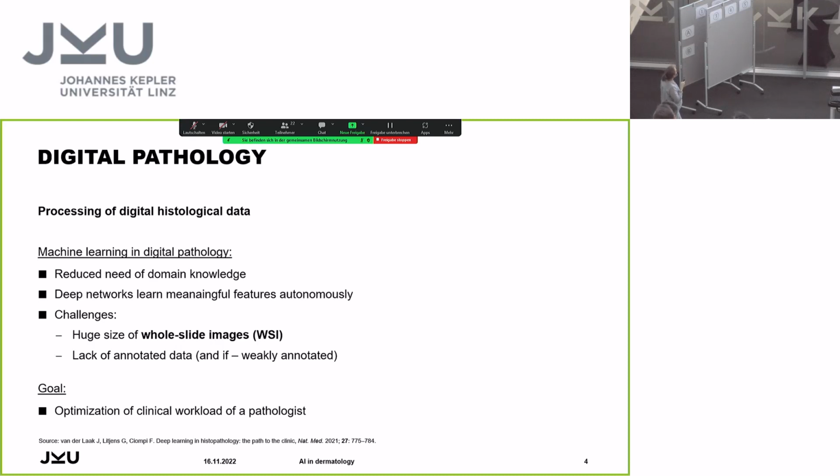That's one of the challenges in working with whole slide images, because there are not a lot of annotated data around, again because there are so few people who can annotate them. Compared to normal images like cats or cars, where everybody can say that's a cat, that's a car, for histopathological images we really need experts. The second challenge is that they are really huge and not so easy to process with computers.